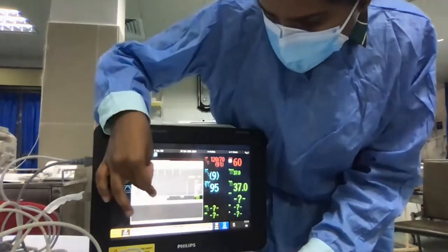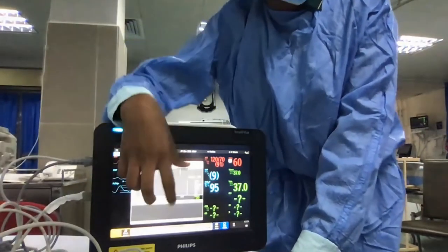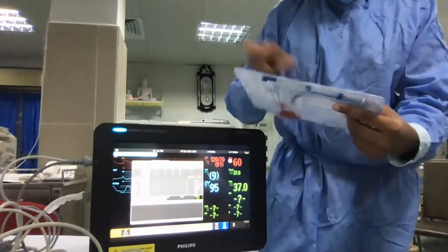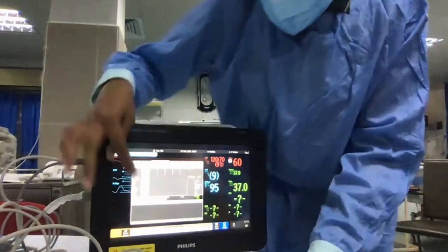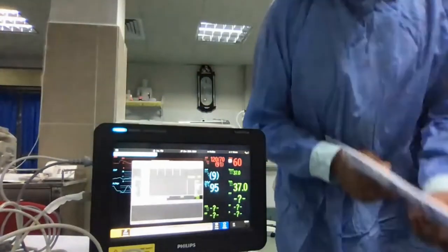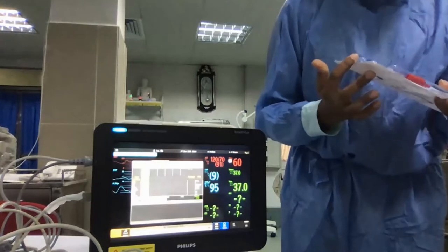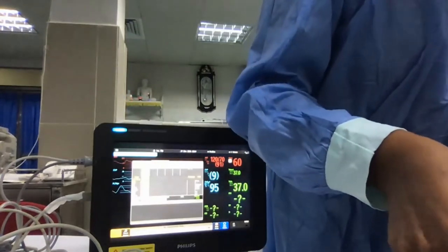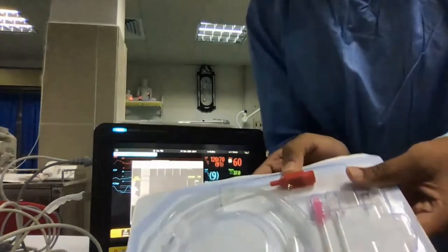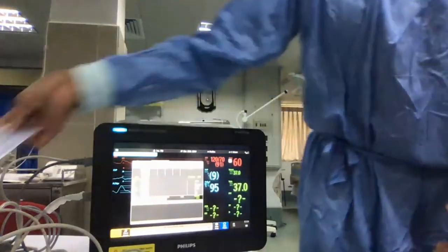So BSA is okay, injected volume is okay, catheter constant. Normally when we insert the PiCCO catheter, it automatically gets the catheter constant. Before, there was a procedure where we could insert it, but they have not mentioned the catheter constant here. So I think it will be automatically detected by the monitor. Catheter constant, what does it mean? I am also not sure about that. Here, the catheter, 342. So just make sure you enter the correct number mentioned over here. Just make sure you enter the same number to this catheter constant, that's it.